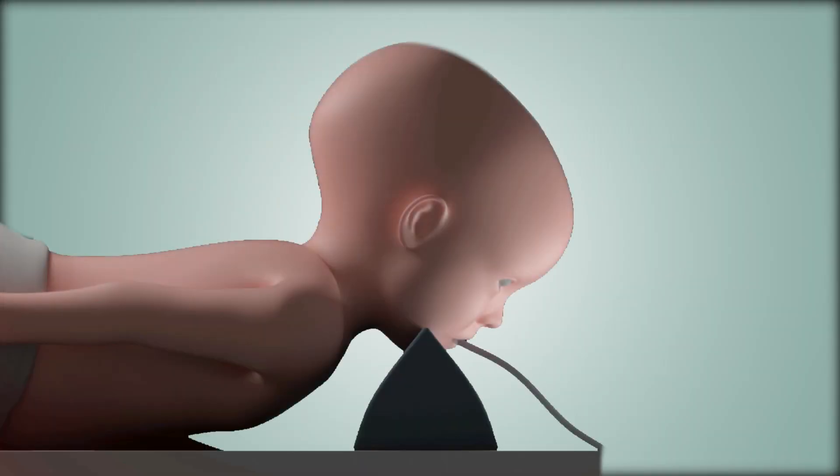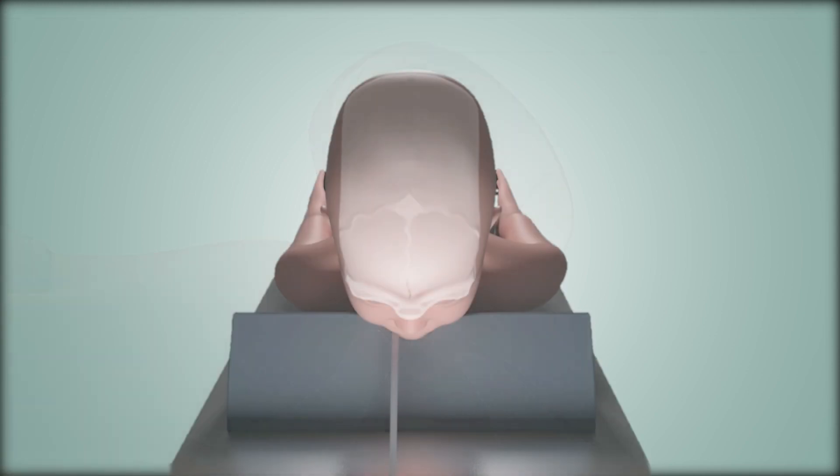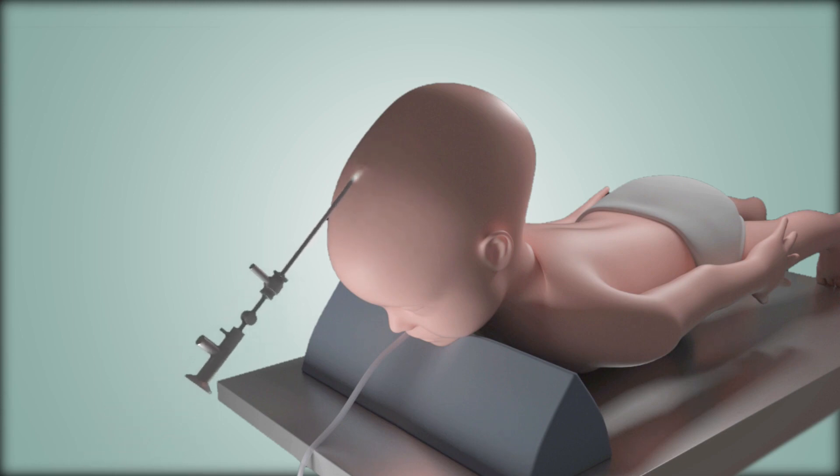Just like the traditional option, this procedure takes place under general anesthesia in the operating room with a full OR staff experienced in craniosynostosis surgery. The child is positioned either on their belly or their back, and a small incision is made over the affected suture. Unlike the large incision needed for the traditional procedure, which extends from one ear to the other, the incision for the endoscopic surgery is only about two to three centimeters in length and is hidden in the child's hair. The surgeon then uses the endoscope and a specialized tool called a rongeur to remove the bone of the fused suture.